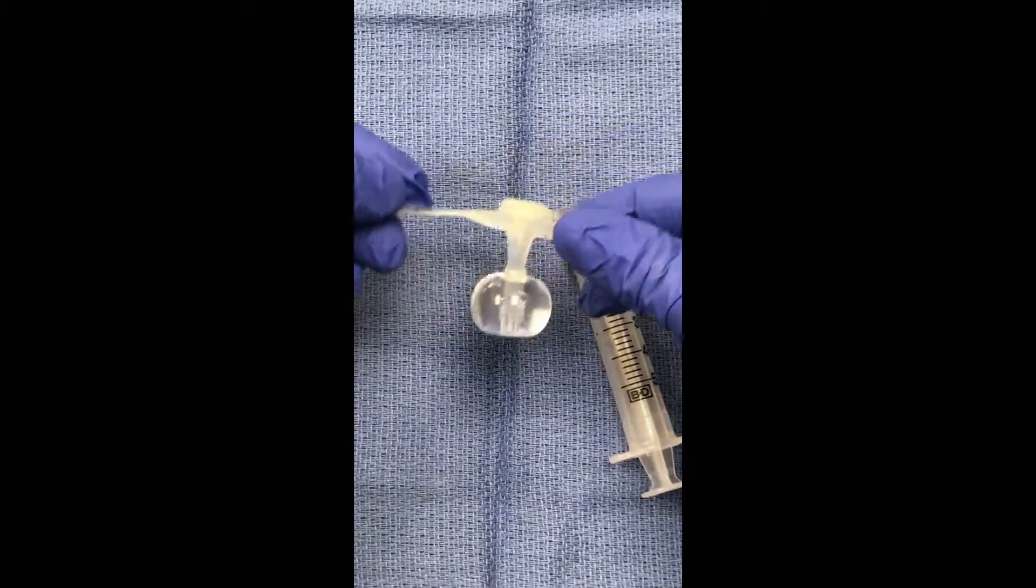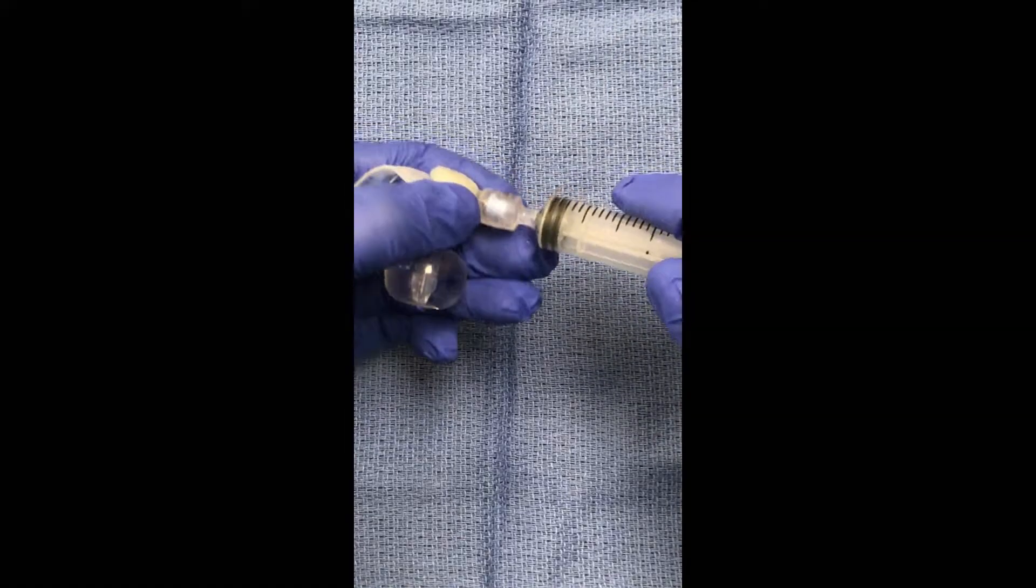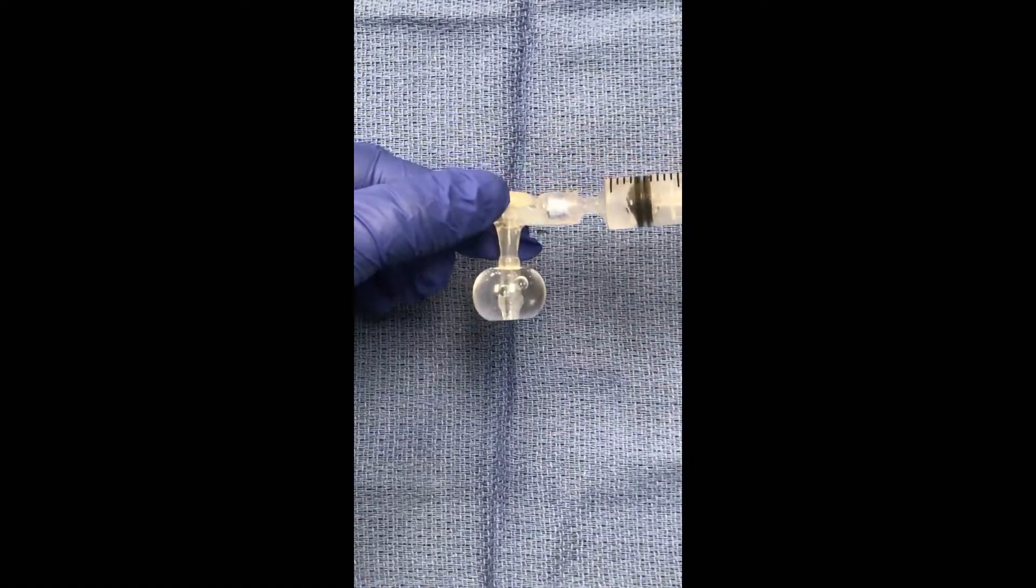See if any water is leaking and if the balloon maintains its shape. To remove the water, reinsert the syringe and slowly withdraw all of the water that you've placed.